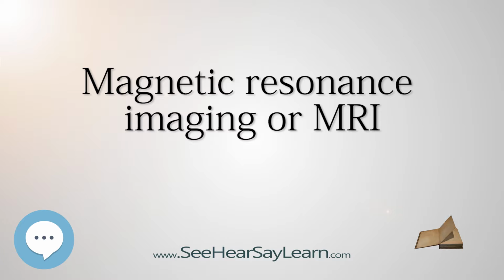In Europe, where more gadolinium-containing agents are available, a classification of agents according to potential risks has been released. Recently, a new contrast agent named gadoxetate, brand name Eovist in the US or Primovist in the EU, was approved for diagnostic use. This has the theoretical benefit of a dual excretion path. Sequences. An MRI sequence is a particular setting of radio frequency pulses and gradients, resulting in a particular image appearance. The T1 and T2 weighting can also be described as MRI sequences.